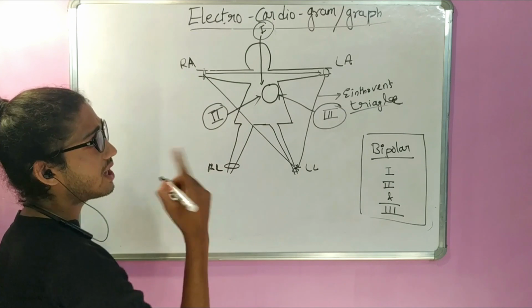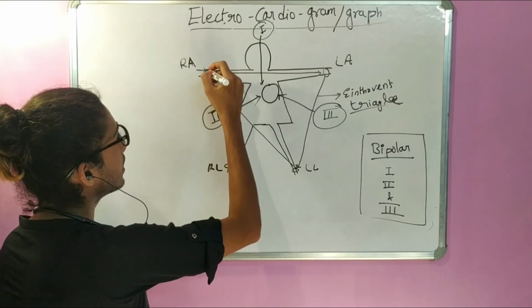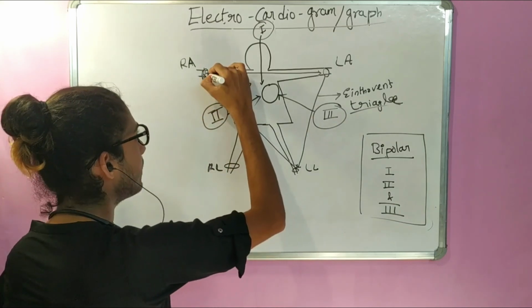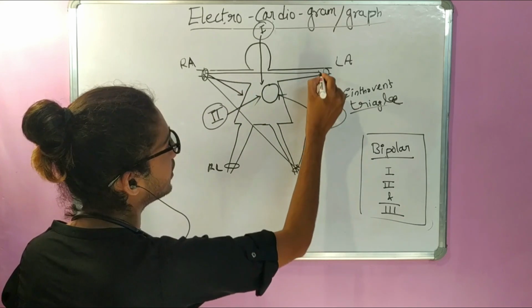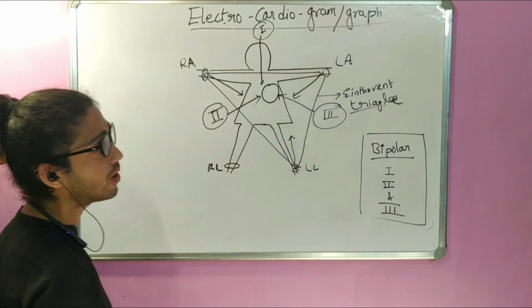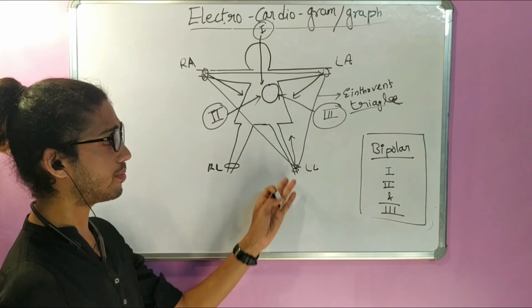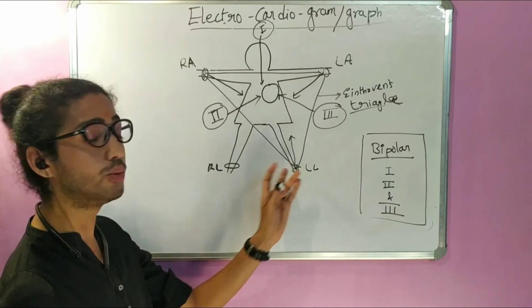Now in advanced electrocardiograph, you get to see unipolar leads. What happens here is basically this electrode itself is going to give out some information, receive some deflection and give out some information to the computer and produce unipolar leads. Why am I calling it unipolar? Because there's only one pole required. The entire deflection is dependent on this one pole. That's why I'm calling it unipolar.